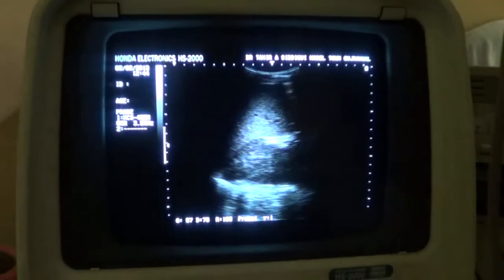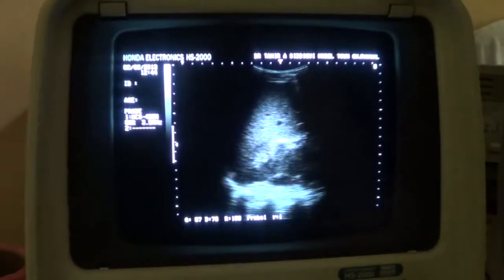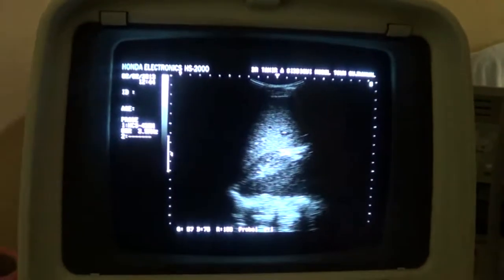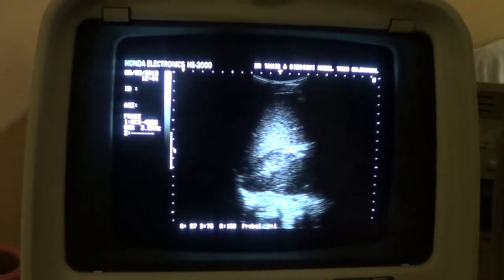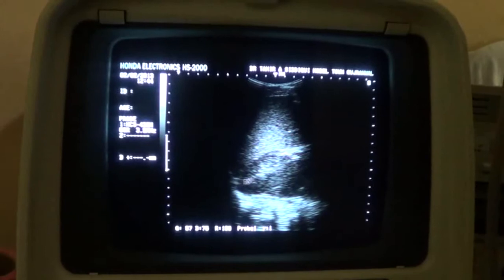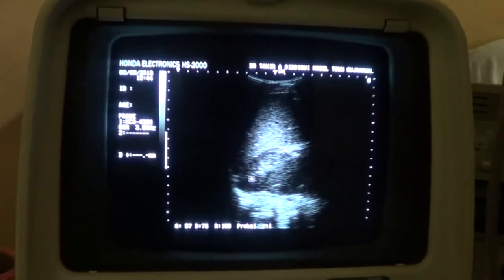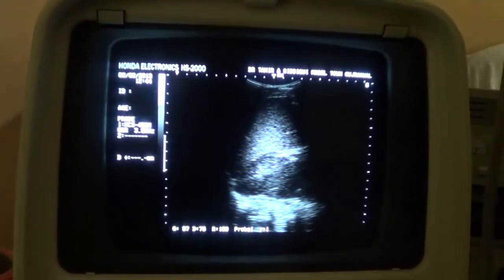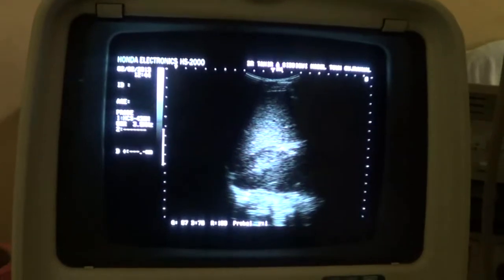This is a diabetic patient, age 35 years. Here we are seeing the right kidney and upper pole, and this is the liver which is fatty. This is the diaphragm.